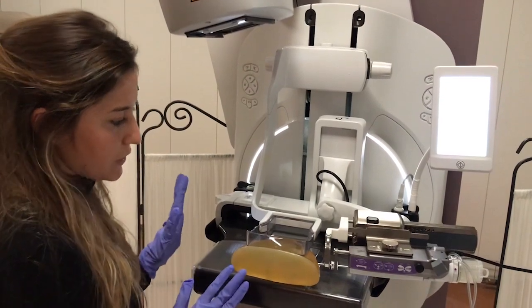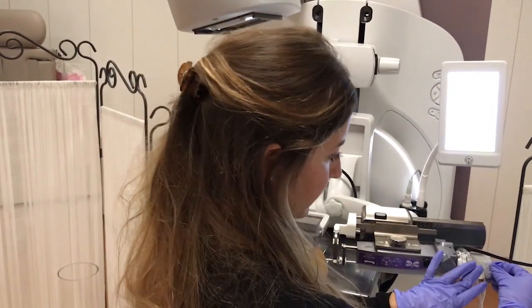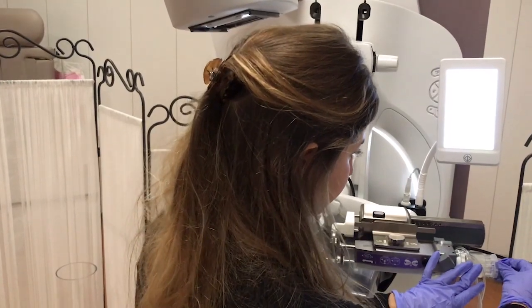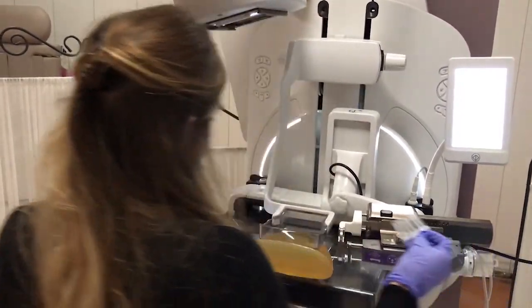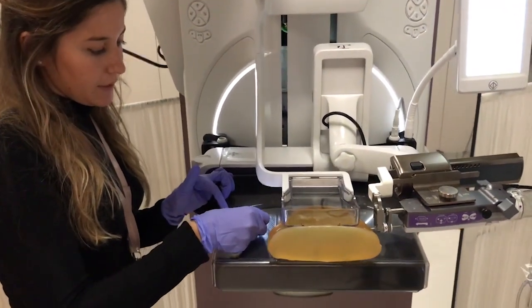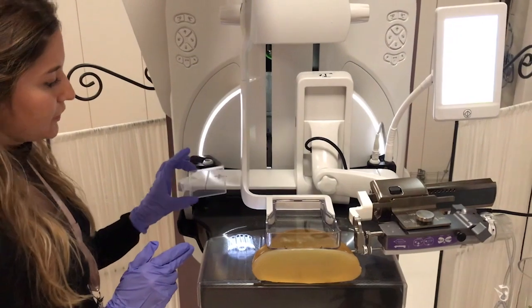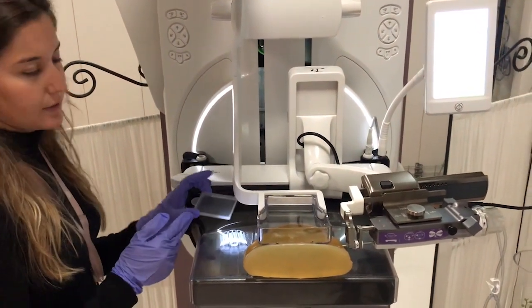During the procedure, when sampling is done, you remove the sample collector here and you just place it right here on the dedicated area, which is shown by the field of view lights. You can also use a little plastic tray to set it on there if you wish.